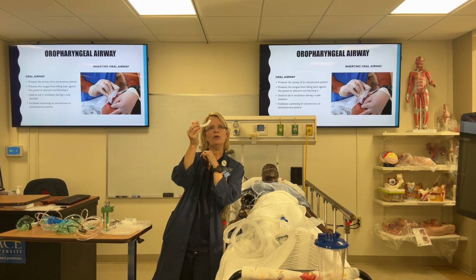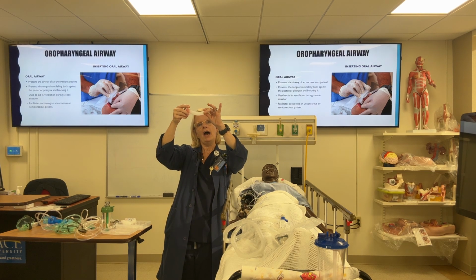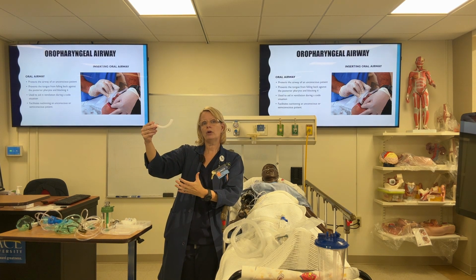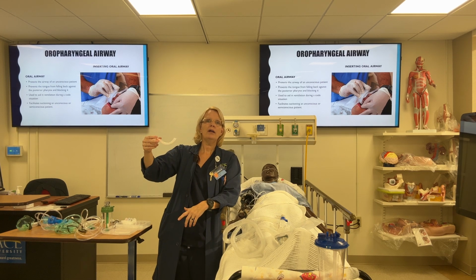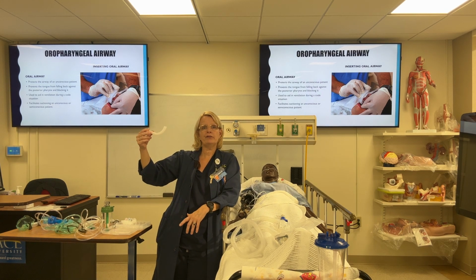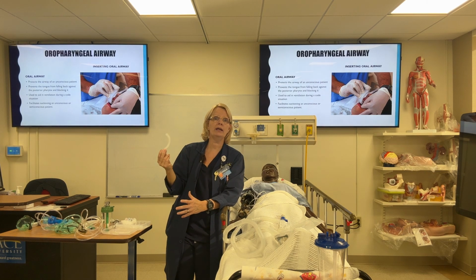When you're putting in an oropharyngeal airway, you'll see that the airway is curved, right? It's curved like the tongue. However, there's a little trick to putting in the airway that you need to know about, because you may end up having to put one in. Even if you're working on a regular floor, you may have a patient who comes back from the OR, seems wide awake, and is in a lot of pain. You go to give them some pain medication, and within 5 minutes, all of a sudden they're obstructing their airway, and you've got to put an oral airway or a nasopharyngeal airway in place.